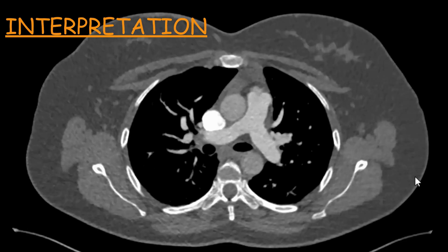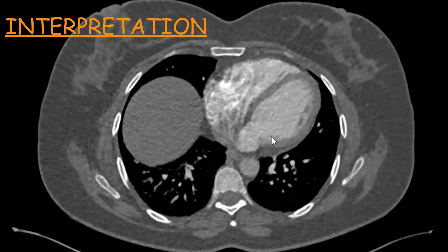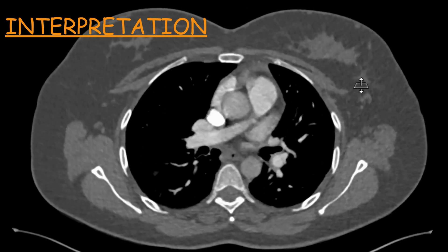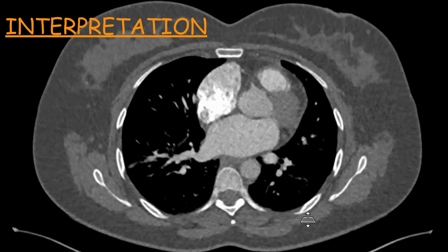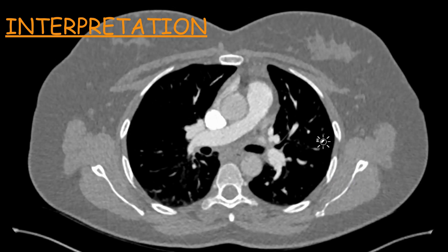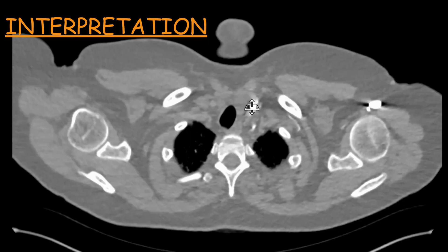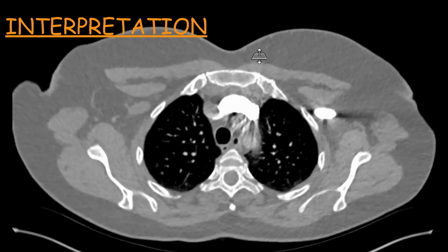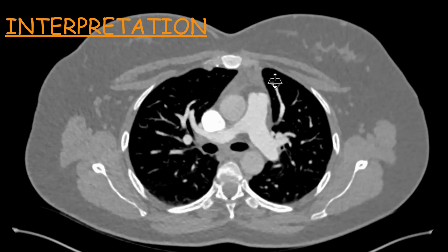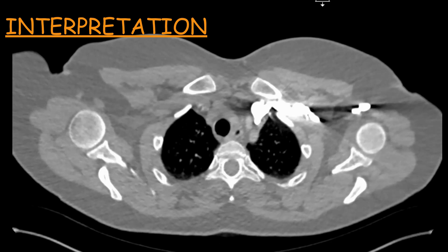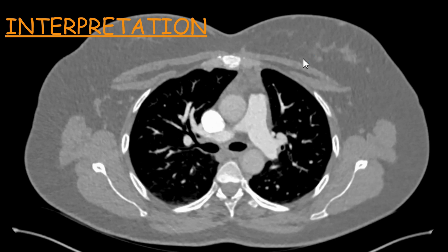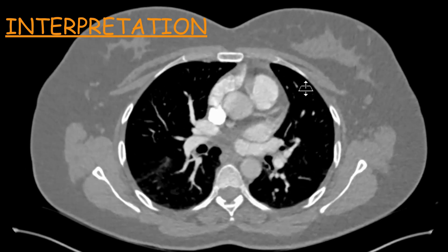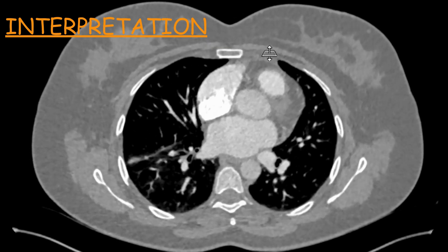How to assess the pulmonary tree for any embolism: I would generally start with the main pulmonary trunk, looking through it starting from its outflow tract, then going up the right and left main divisions, the lobar divisions on either side, and then segmental and subsegmental. Sometimes you're not able to see subsegmental divisions, and in that case you need to mention in your report to what level you could say with certainty that there were no filling defects or otherwise.